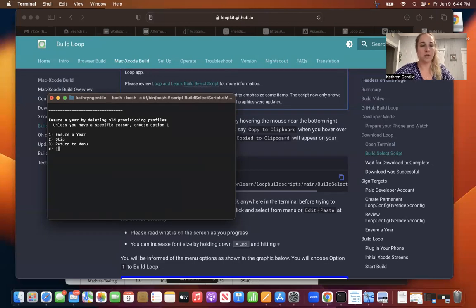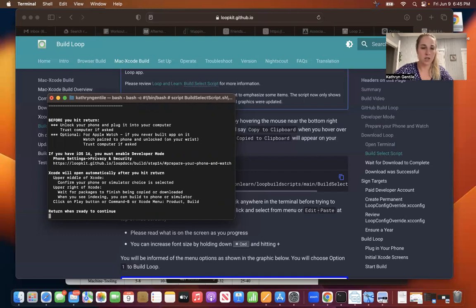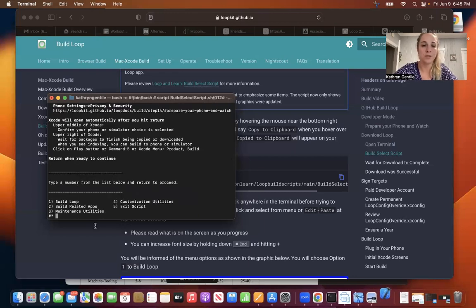You do want to ensure that you're resetting those provisioning profiles, because that is what will determine when your Loop app expires. So if you don't reset the provisioning profiles, then you might wind up with an app that only lasts like 3 months or something. So yes, very nice that they asked this now. We are going to do that. And we are now unlocking your phone, plugging it into the computer, which I actually don't even have my cord over here, so I'm not going to do. I'm just going to hit return. And then Xcode is going to open up.